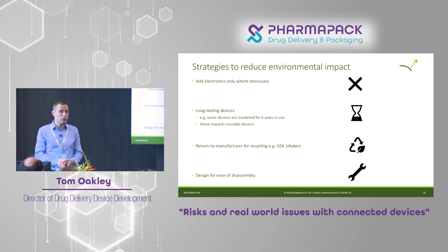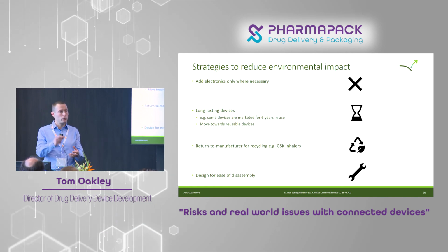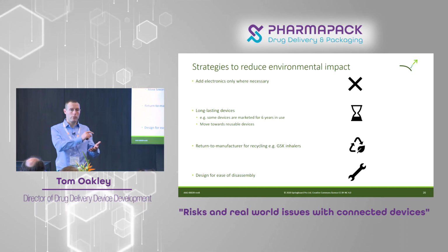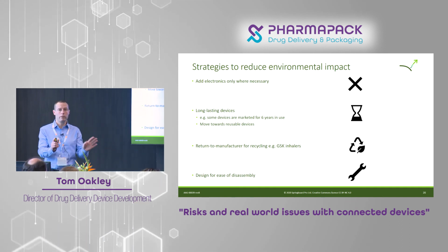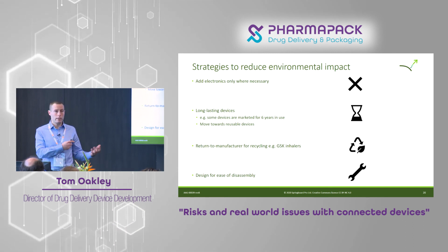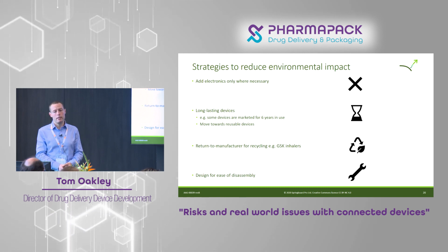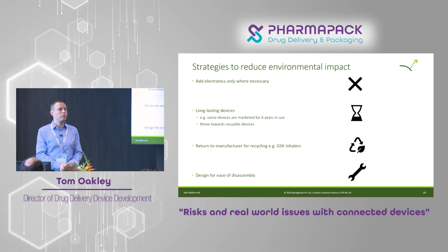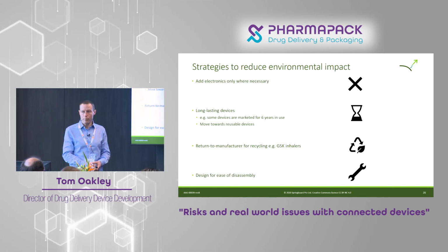GSK is already doing this for their inhalers like Ellipta, where when you get the inhaler, it has a package that you can then put the inhaler into with an address on it, and it just goes back to them. They disassemble it and try to recycle. And then also we, as device engineers, I don't know if you guys are device engineers, but we as device engineers can design for ease of disassembly to make that recycling much easier. These are all things we can do.